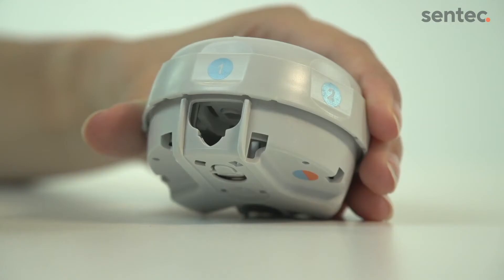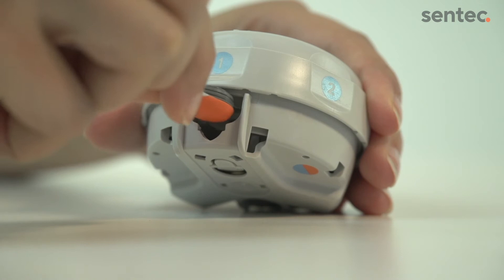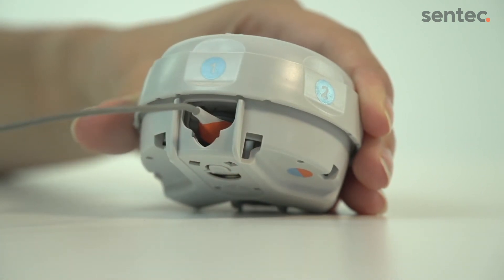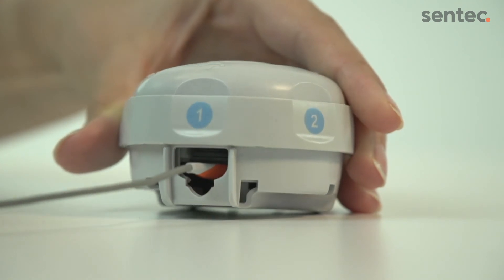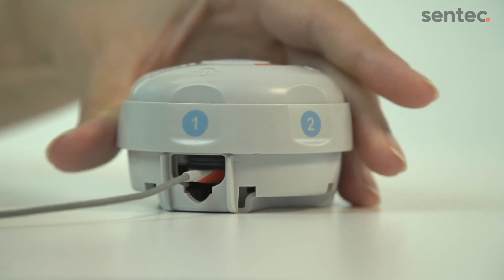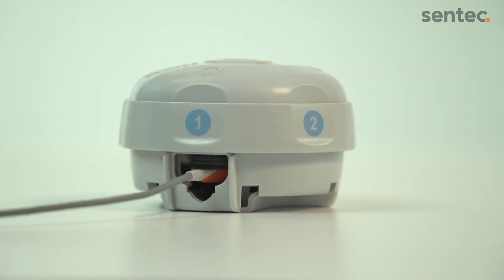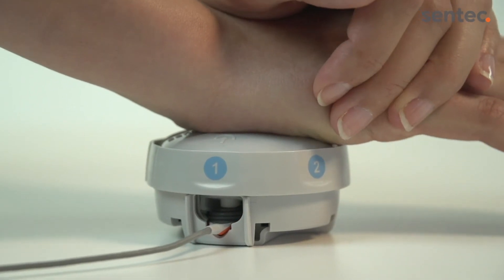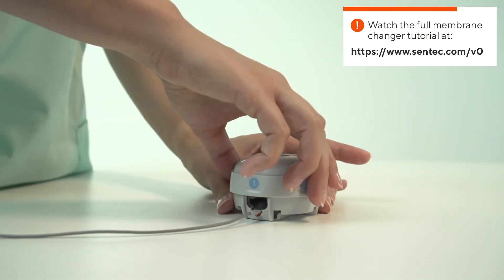Once the sensor is dry, you will need to replace the membrane. Carefully insert the sensor into the membrane changer without touching the exposed sensor surface. Make sure the sensor is aligned correctly, then proceed with the membrane change as usual with the alternating pressing and turning steps.